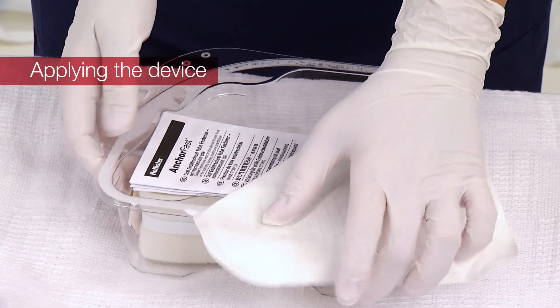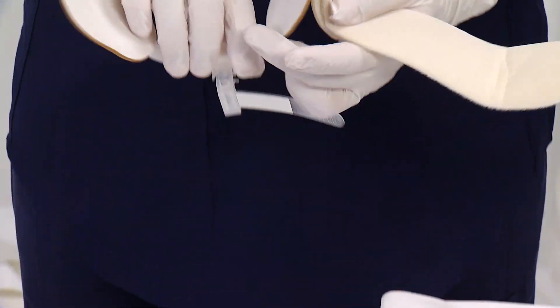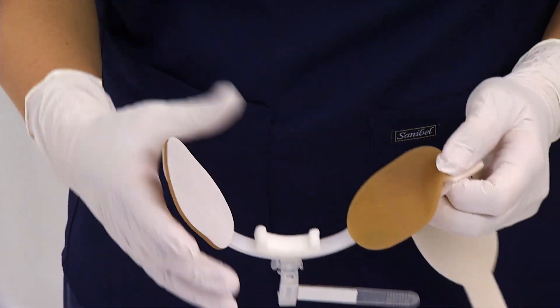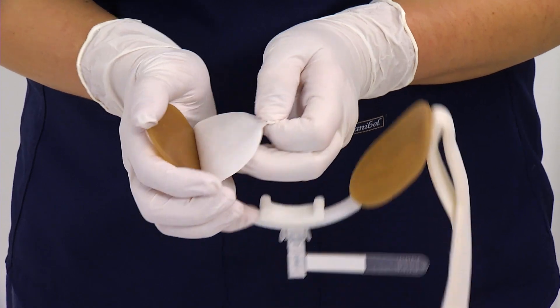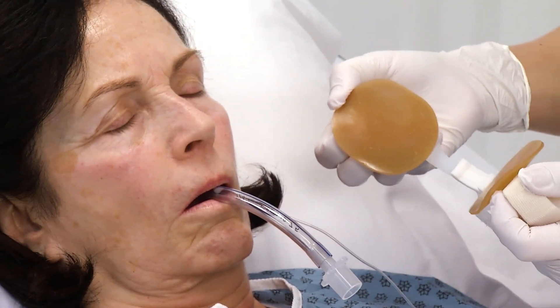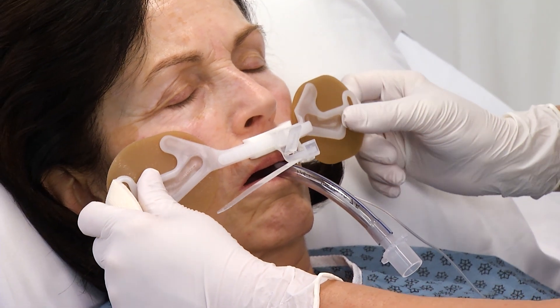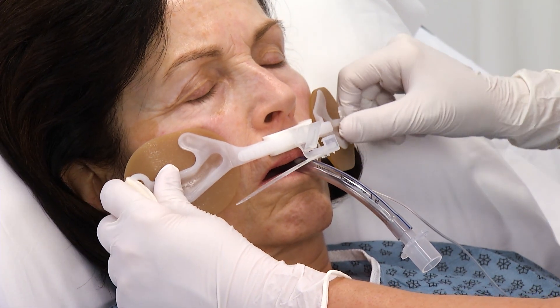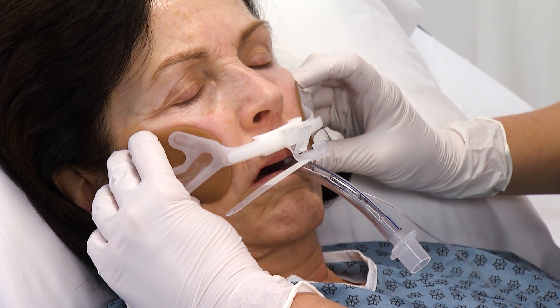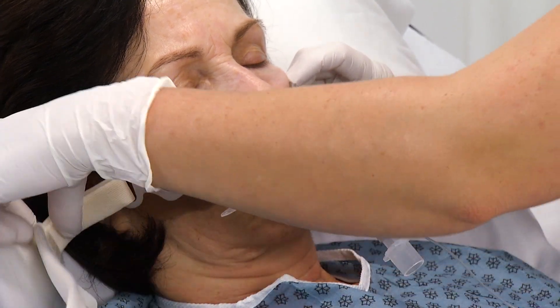Remove the product from packaging. Remove the release liners from the two skin barrier pads. Pull back gently on the skin barrier pads so they are out of the way to prepare for application. Center the device on the patient's upper lip so the non-absorbent upper lip foam lightly touches the skin. Press the two skin barrier pads on the patient's skin and hold in place until they adhere well. This should take approximately 30 seconds.